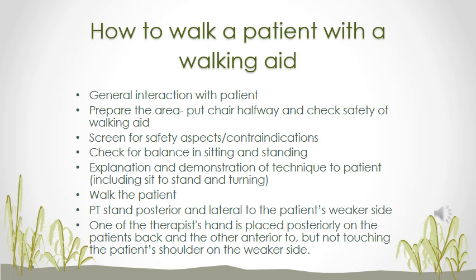Where will you stand? You, as their physio, have to keep the patient safe. So you are always just behind and to the side of your patient's weaker side. So posterior and lateral, your hand always close to the lower back, one hand slightly in front of them, so that if they want to fall to one side, you can quickly grab hold of them and keep them safe and upright.